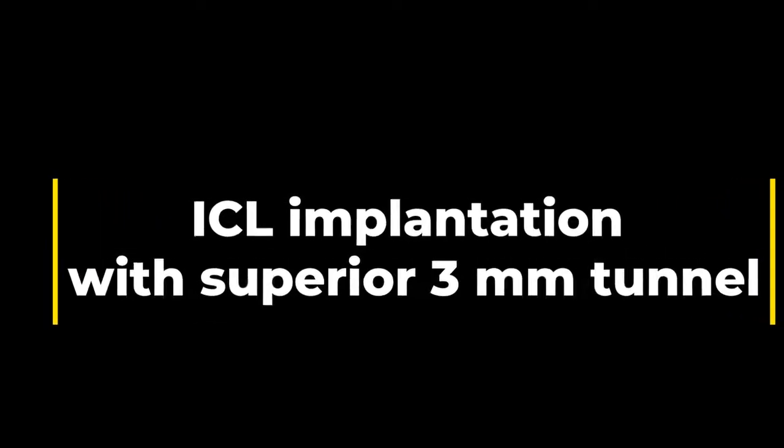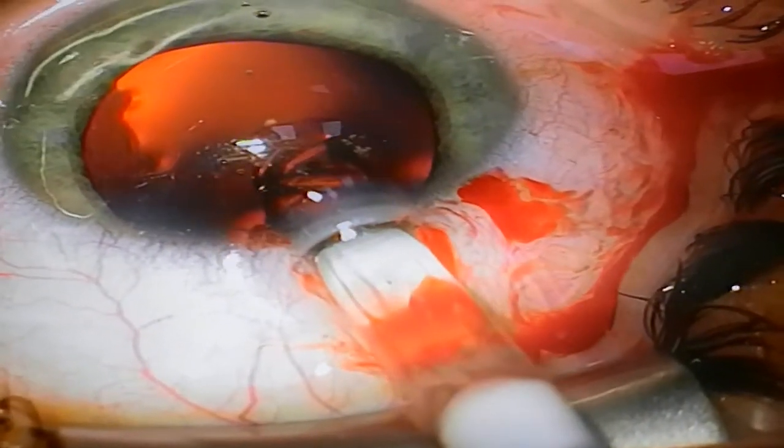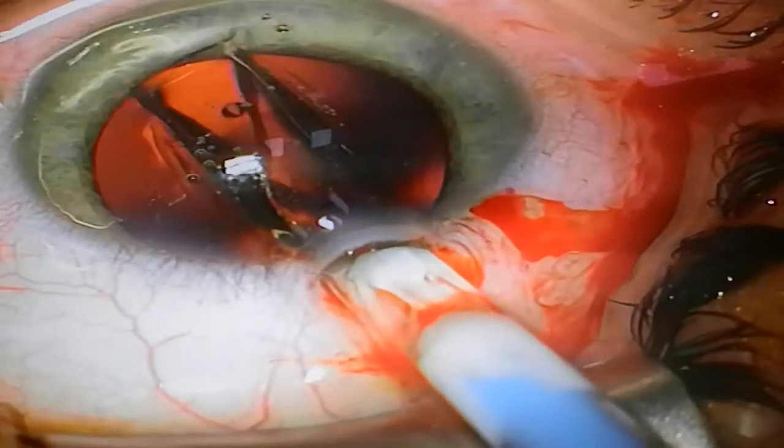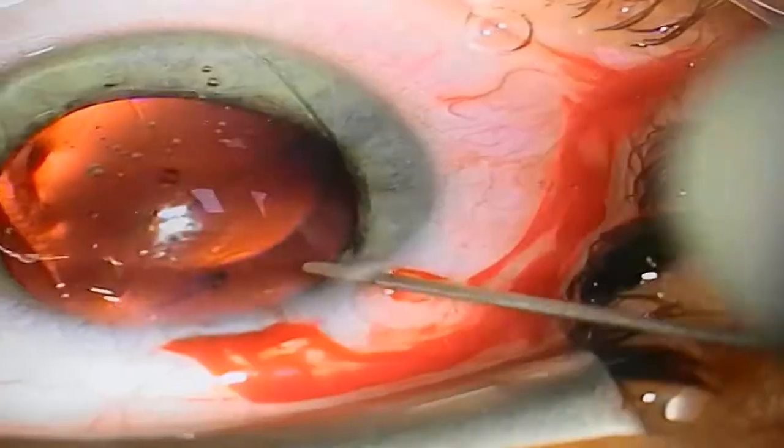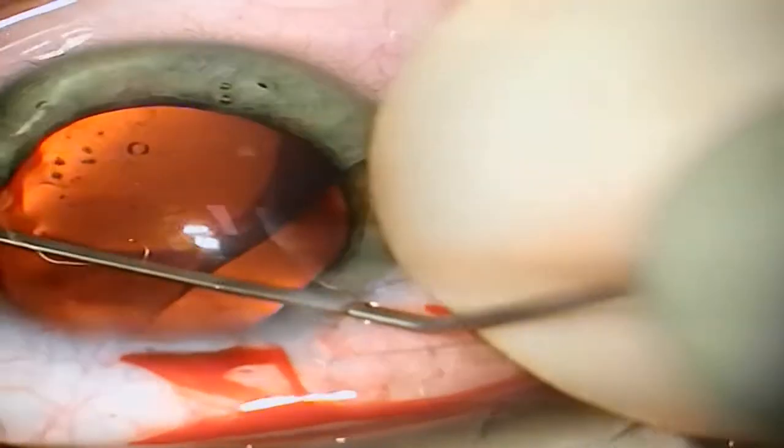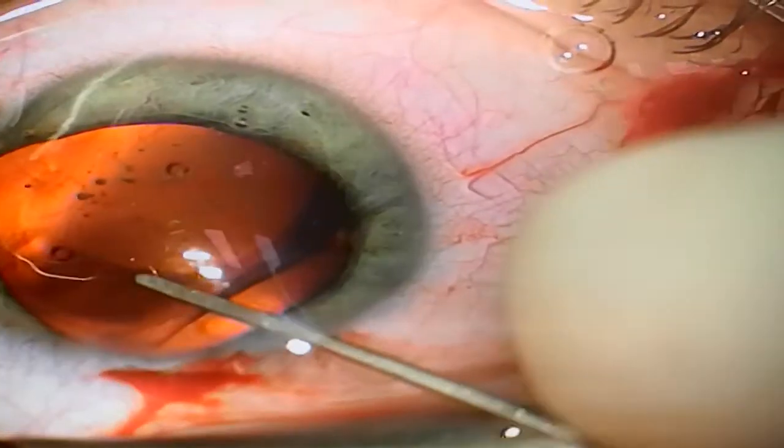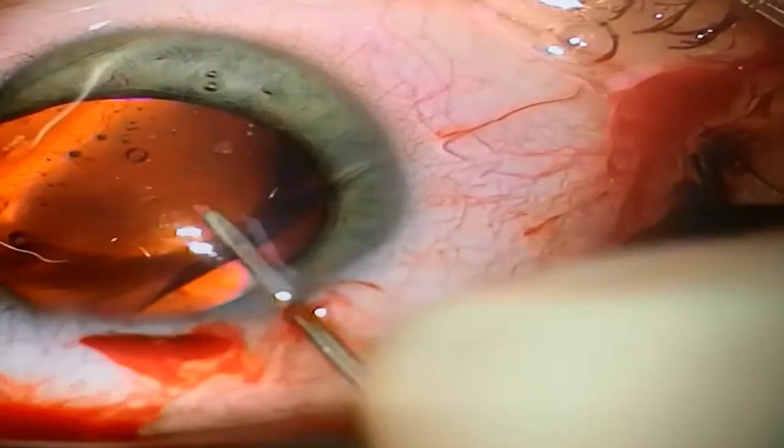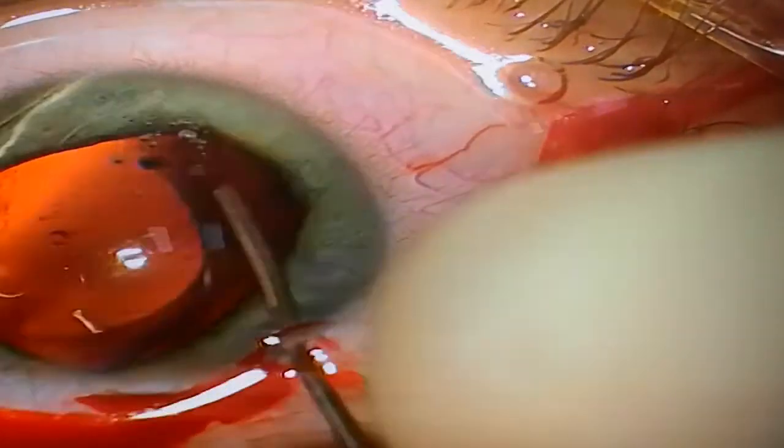Very easy. And after we loaded the lens, we use the normal technique of implanting the lens, which we all know. Here we chose a superior tunnel. It is supposedly more difficult, but I find it very helpful in correcting a very small amount of astigmatism, which is normally with the rule. This way the wound is also covered by the upper lid and is more protected.